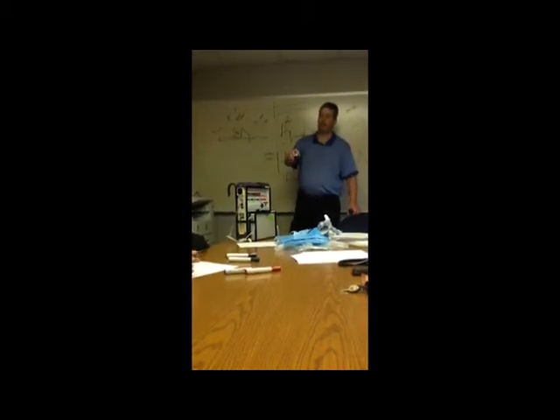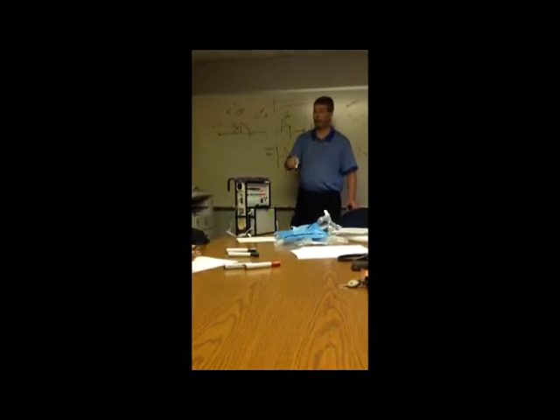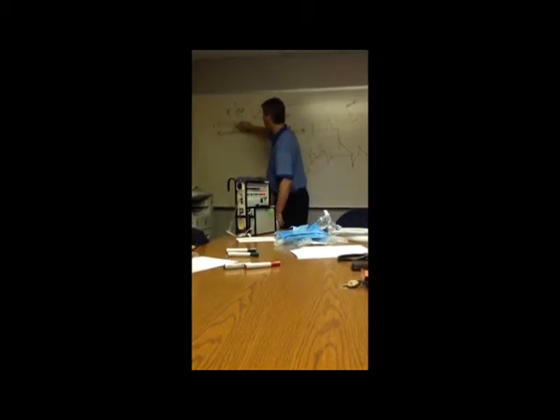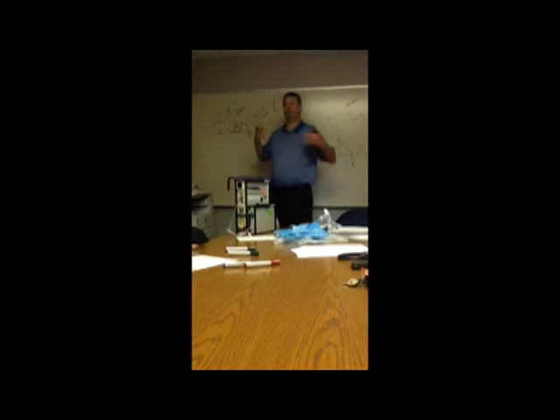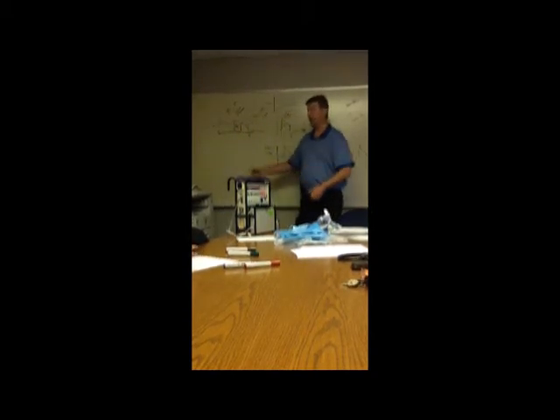So if I'm on 15, do it on your vent and make it easy. If I'm on 15 over 5, and their SATs are terrible on 100, I'll go up to 15 over 10 on yours, because yours is on top of that peak. They're going to be peaking at 25. You kept what I said was the delta P to help with the inspiratory part the same.